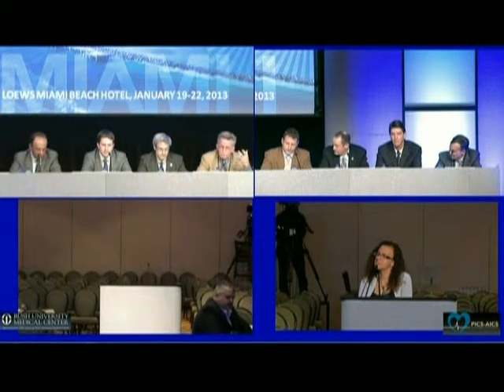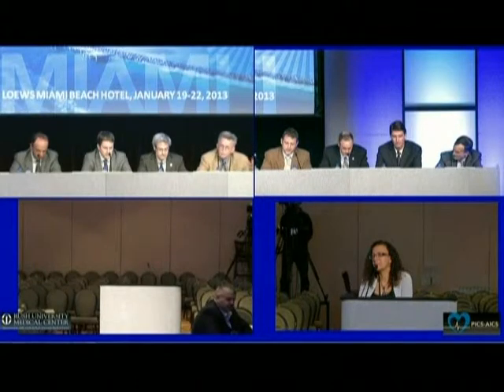Yeah, just to expand upon that, because when I talked to Evan about this, we were interested in the same thing, and he had gone through two injectors and all that, except there's only one injector that can be hooked up to the system that tells it when to inject, and otherwise you time it. So what my guys did, I said, well, this is kind of stupid. So what they did was a single injector that is timed for the spin, and then we just do a Y port.